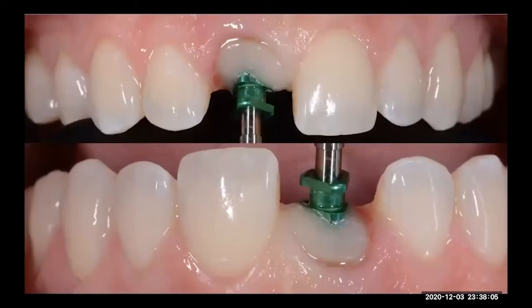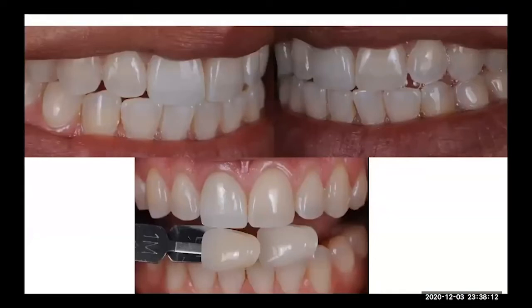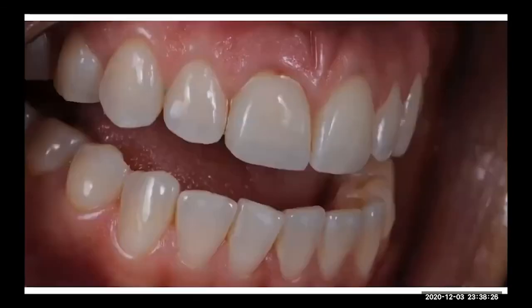He did all his job, a really nice job. He gave me the information of his soft tissue. We did a try-in, the same problem. Everything was a little bit light because I think the technique of taking the color is really, really sensitive. Then we modified the tooth, and this is the day of the delivery. We can see the integration of our single crown in the mouth.